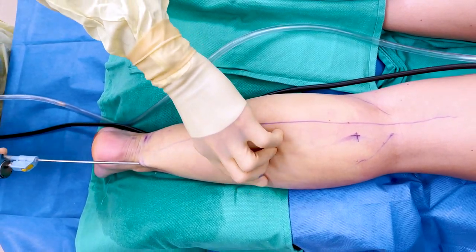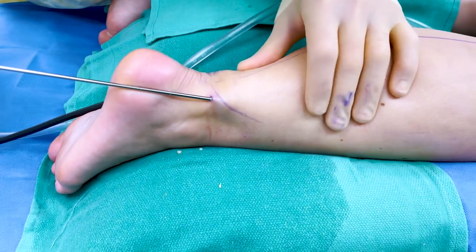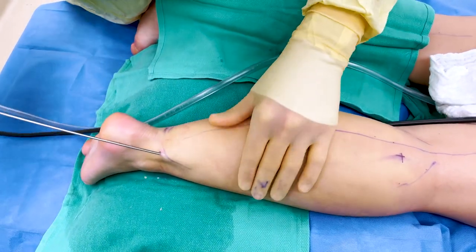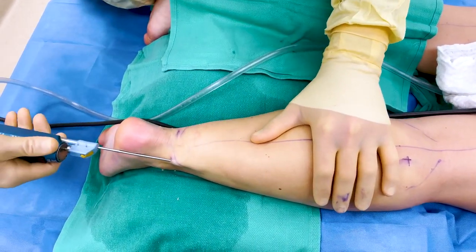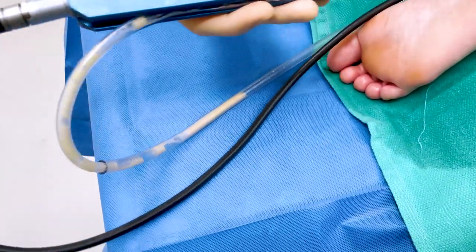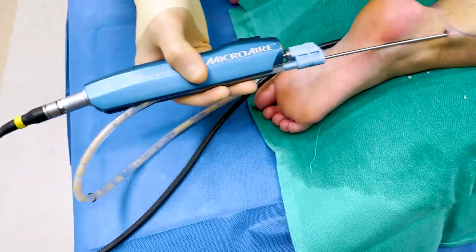We're going to start our liposuction now. This should look pretty satisfying. We're going to get all this fat out. Now it's all liquefied in there, and you can actually see the fat starting to come out — this nice white substance that shows that our tumescent really worked.